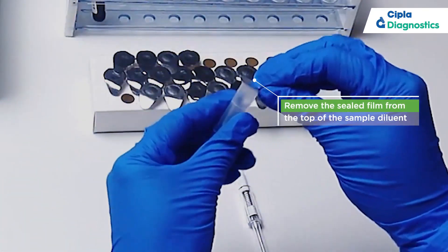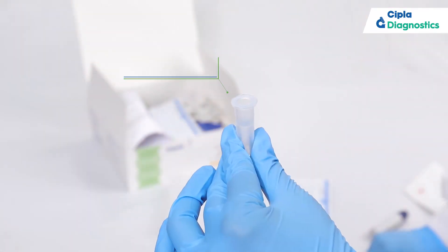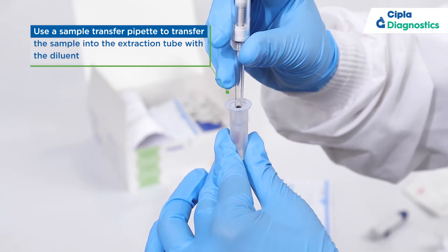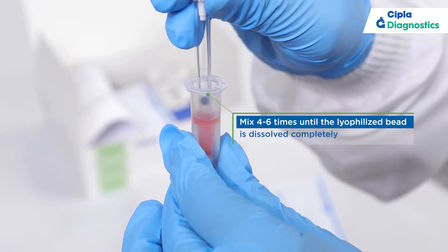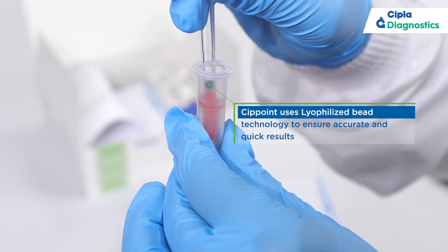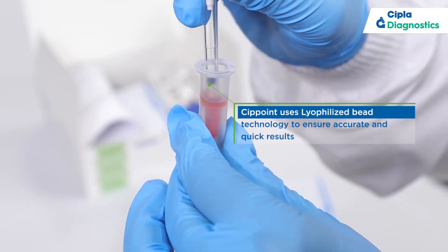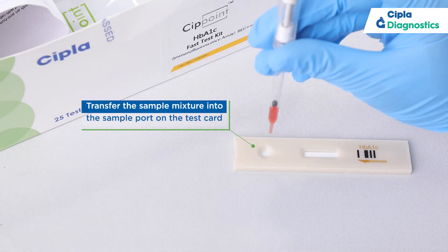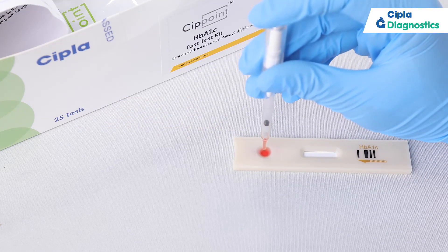Remove the sealed film from the top of the sample diluent. Mix four to six times until the lyophilized bead is dissolved completely. After the bead is dissolved, transfer the sample mixture into the sample port on the test card.